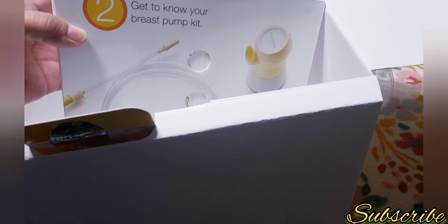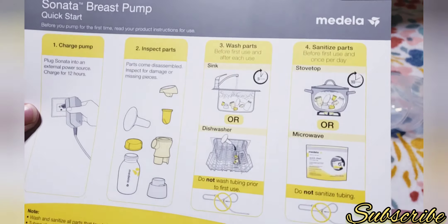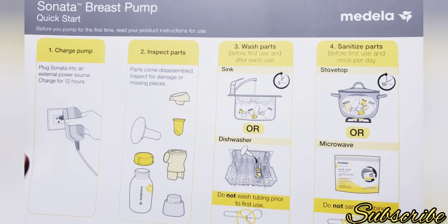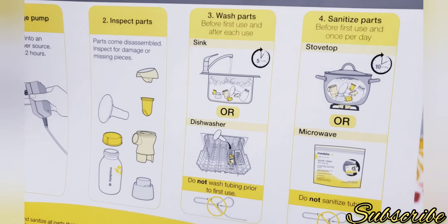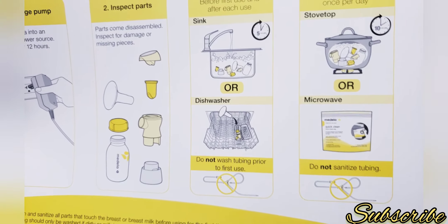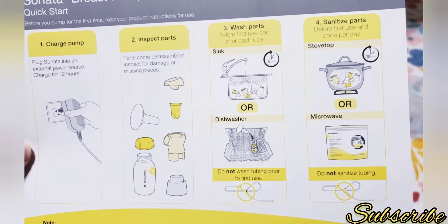When you open this little box it shows the breast pump quick start guide: number one, charge the pump; two, inspect the parts; three, wash the parts — you can use the dishwasher too; and four, sanitize it on the stovetop or in the microwave with a microwave bag. It also says do not sanitize or wash the tubing before first use. Really simple, easy instructions.